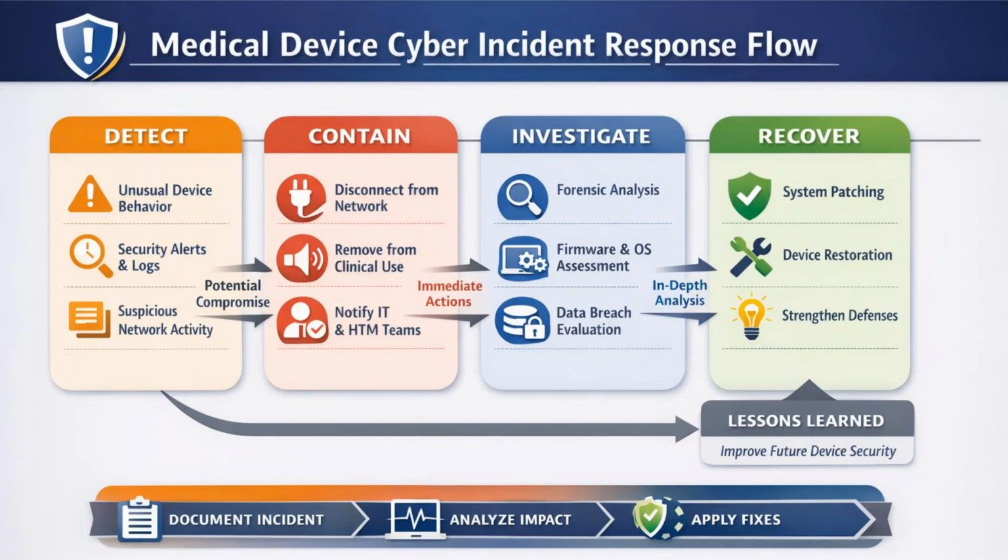The investigate phase, blue, involves an in-depth analysis, forensic analysis, firmware and operating system assessment, and data breach evaluation. This is where we determine what happened, how it happened, and the extent of the compromise. Investigation takes time and expertise, but it's essential for effective remediation.